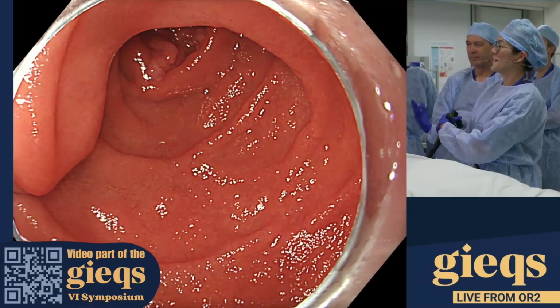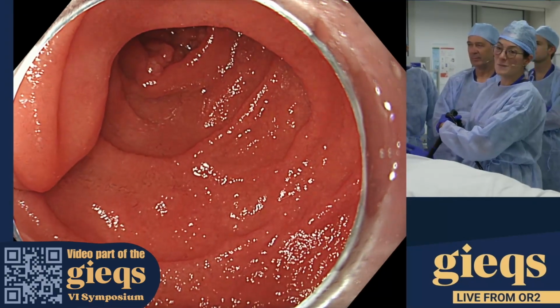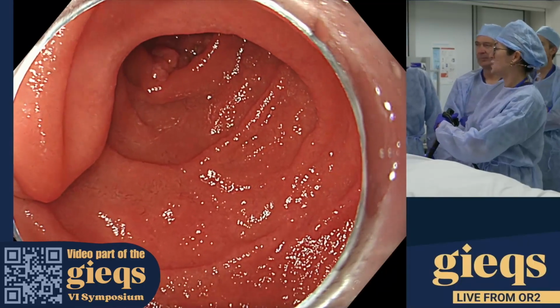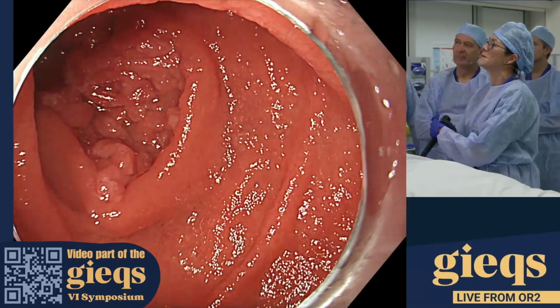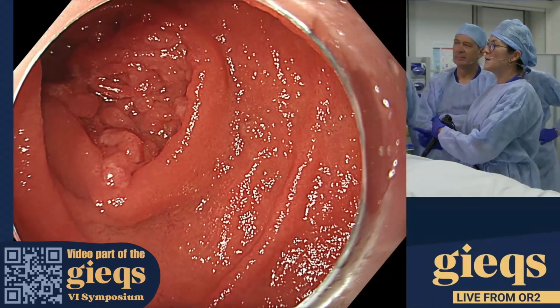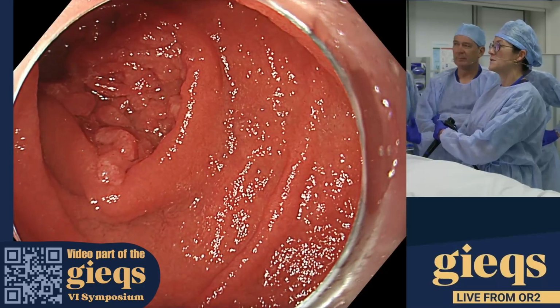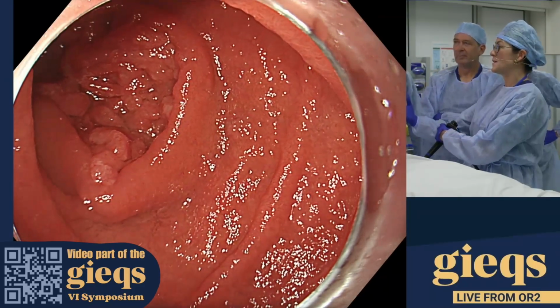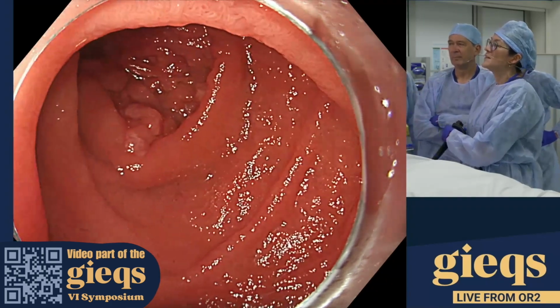But of course, I'm very happy to demonstrate to you how to image the adenoma, and we can have a discussion on what you would like to know as a physician where we would refer to. Maybe good to say we already gave the patient a bit of Buscopan because there was a lot of peristalsis, and of course we want to do optimal imaging, and as you can see, that helped very well. So we have a very nice and still duodenum at the moment.